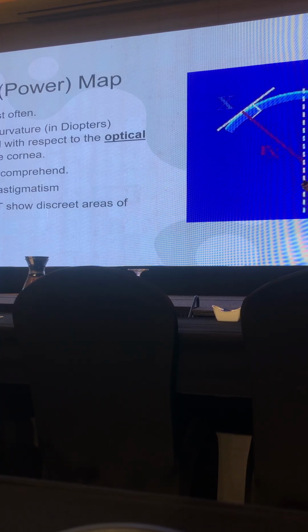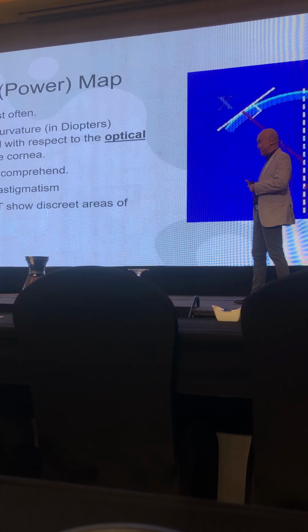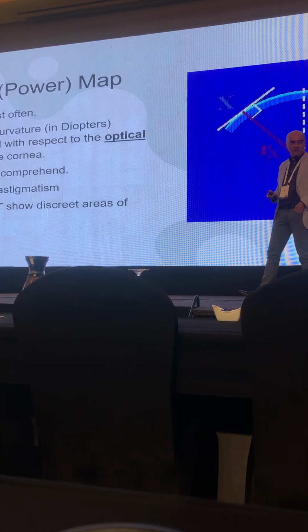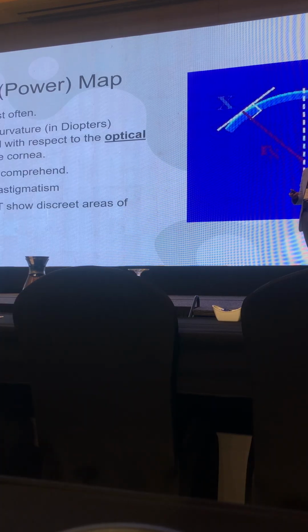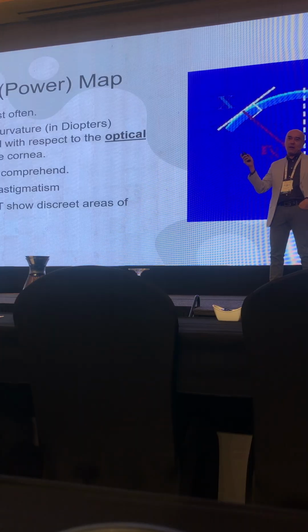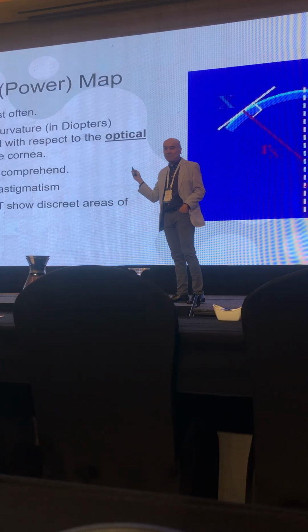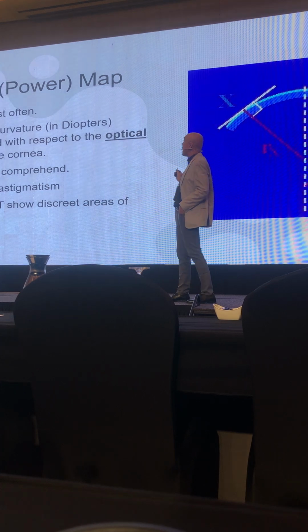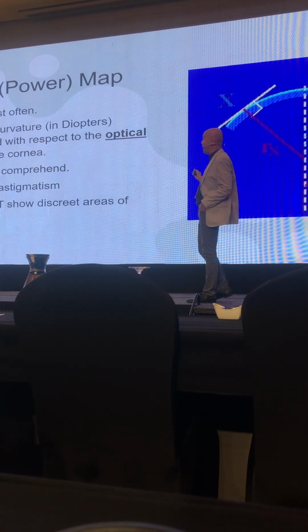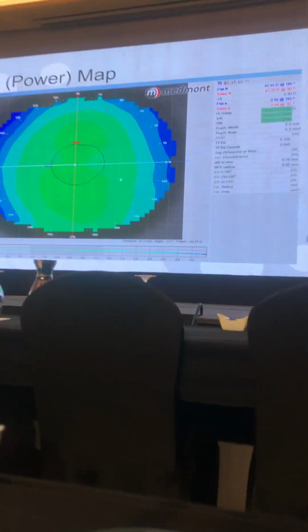So Steve always mentions axial map is very important. Don't send him a tangential map for designing lenses, okay? Axial map is very, very important. And also, when you look at the axial map, you know whether the cornea has an amount of astigmatism. How many mountains there are? Yeah. Right? Okay, what's next? Axial map. This is our axial map.